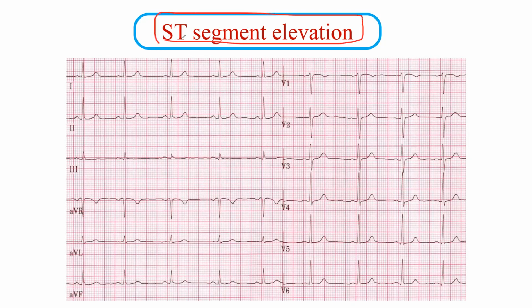Now, when we see ST segment elevation, we always think about myocardial ischemia or infarction, which is actually the most important cause of ST segment abnormalities, right? But we have to know that there are multiple other causes that can give us ST segment elevation as well. So you have to think about the patient's symptoms and some features of the ST segment elevation to properly identify the diagnosis. So what is the ST segment?